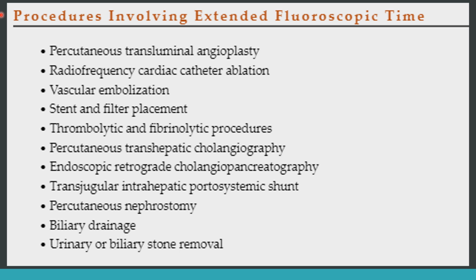Procedures involving extended fluoro time. So percutaneous transluminal angioplasty, radiofrequency cardiac cath ablation, vascular embolization, stent and filter placement, thrombolytic and fibrolytic procedures, percutaneous transhepatic cholangiography, ERCP, transjugular intrahepatic portosystemic shunts, percutaneous nephrostomies, biliary drainage, and urinary or biliary stone removal.